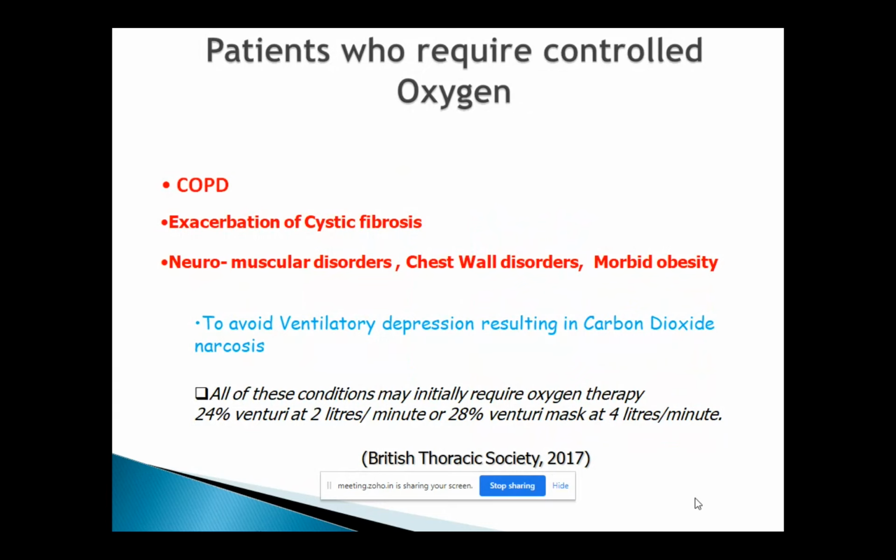For all of these conditions, I want you to be very clear about this. Start with oxygen therapy of 24% Venturi, which is your blue valve, and it will say 2 liters, and then you can slowly increase to 28. The advantage with these devices is, if somebody is not achieving their oxygen saturation, you could start them on a basic low one, which is your 24%. Start them, monitor them, do their saturation, and see how they're responding. Obviously, whatever their underlying problem, the treatment would also have been started. And if they're not achieving the saturation, then you can go to the next step.